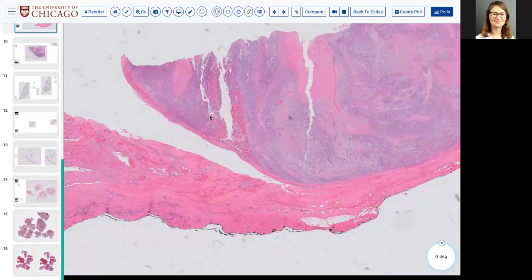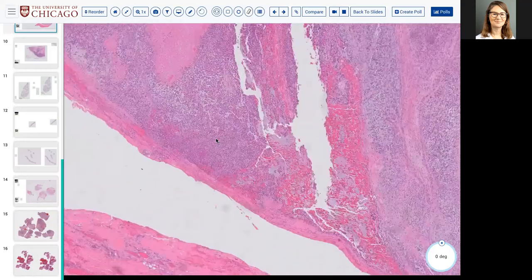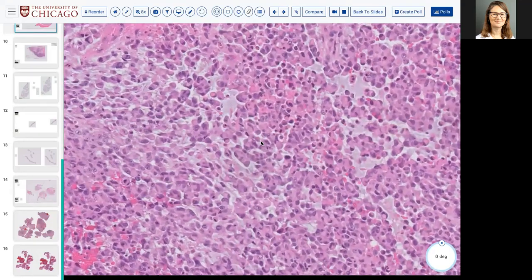The profile in salivary glands, they tend to have more myoid markers like SMA, calponin, P63. In non-salivary sites, they tend to have more like S100. I'm going to actually even add in there SOX10, GFAP, but it's thought that they're sort of similarly patterned. How do you tell? Can this have INI1 loss? Yeah, some of them do. So yes, some of them have INI1 loss. So now you're sort of relying on the immunoprofile to differentiate epithelioid sarcoma versus myoepithelioma.